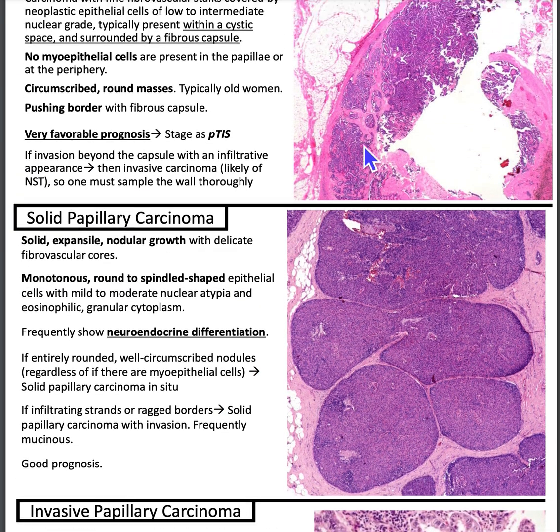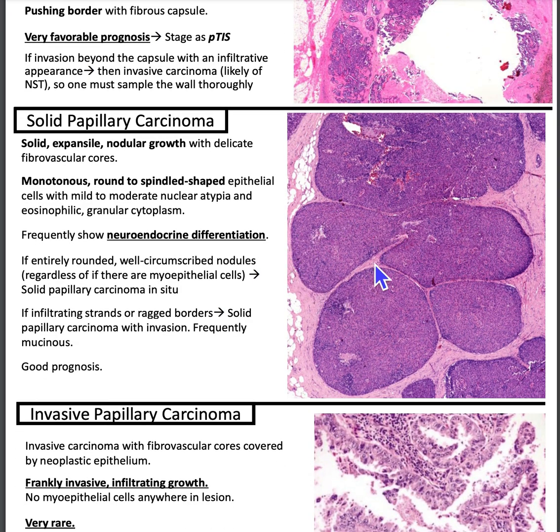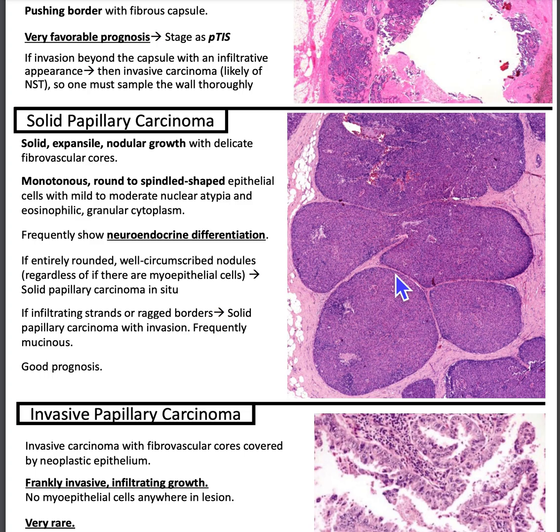Compared to the delicate fibrovascular stalks of encapsulated papillary carcinoma, solid papillary carcinoma is more cellular with small delicate fibrovascular cores. The cells are monotonous, round to spindle-shaped, with mild to moderate nuclear atypia and eosinophilic granular cytoplasm. It often shows neuroendocrine differentiation, confirmed with synaptophysin and chromogranin staining, and can show mucinous features as well. If entirely rounded, well-circumscribed nodules are present — regardless of myoepithelial cells at the periphery — it's solid papillary carcinoma in situ. If there are infiltrating strands or ragged borders, it's solid papillary carcinoma with invasion, and this variant frequently shows mucinous features.